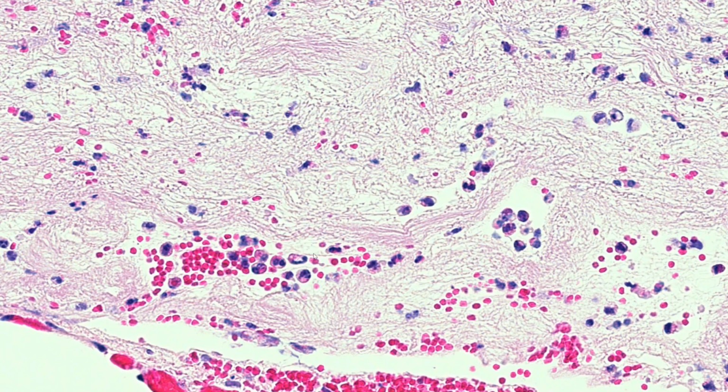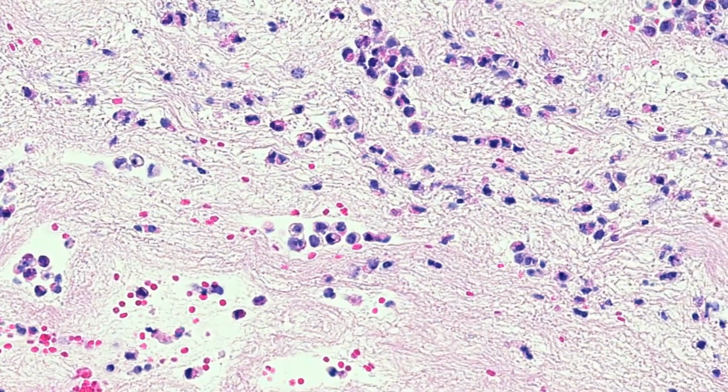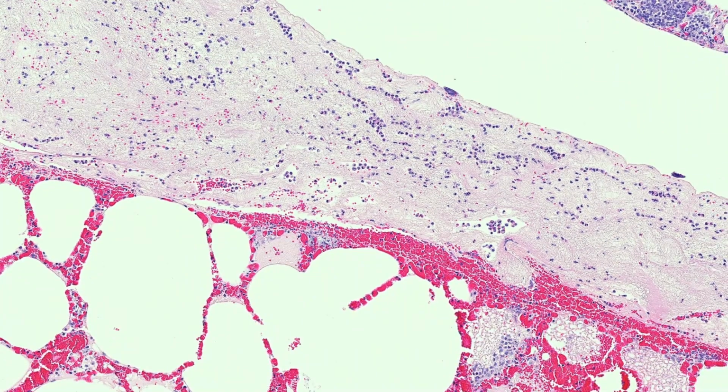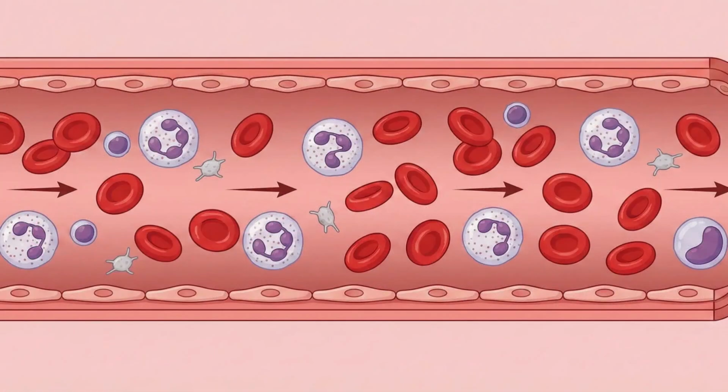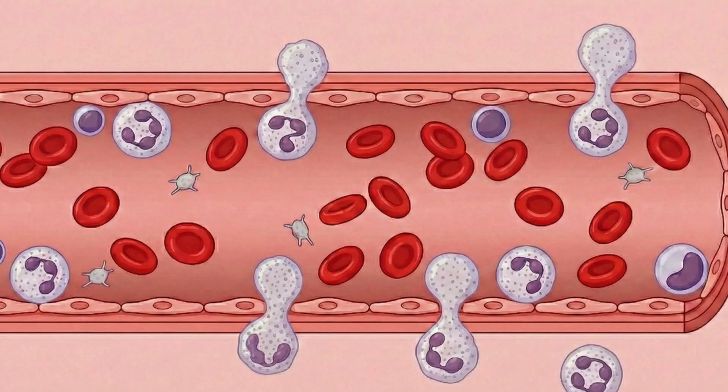So a neutrophil will have a segmented nucleus with about 3 to 5 lobes connected by thin strands. It looks a bit like a string of beads or a twisted sausage or something. During acute inflammation, neutrophils move from the blood vessels into the tissues. How they do that exactly is the subject of another unlikely very long video. If you look at a dilated blood vessel, normally cells flow in the center, but during inflammation, neutrophils will move to the periphery of the blood vessel and then begin to stick to the side. These processes are known as margination, rolling, and pavementing.